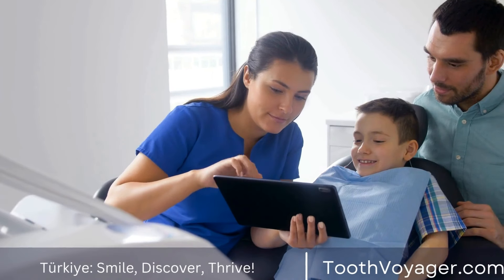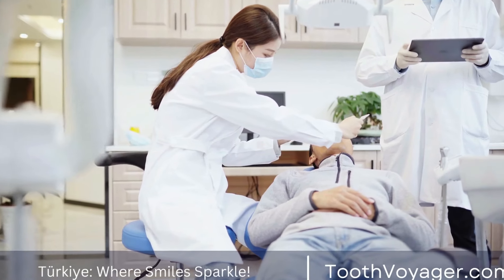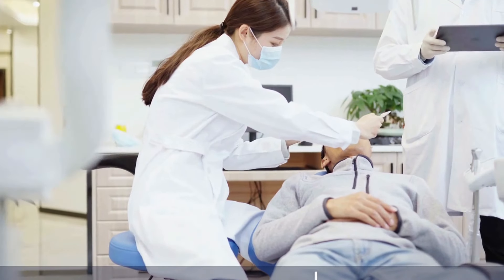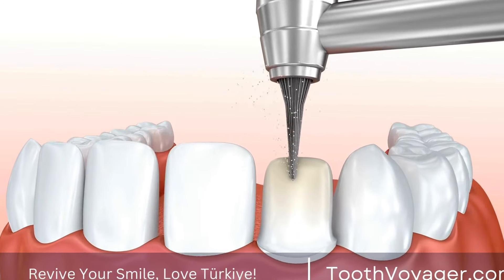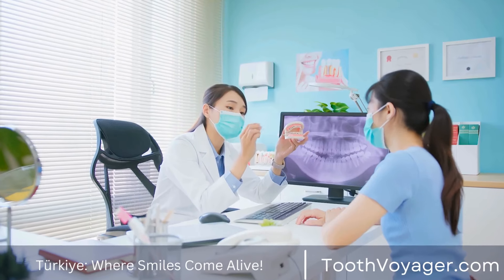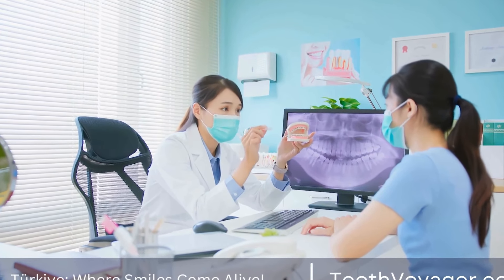Step 3: Accessing the Pulp. When the tooth has become numb and isolated, the dentist will make tiny holes in the crown of the tooth in order to reach the pulp chamber. The pulp is a soft tissue within the tooth which contains blood vessels, nerves, and connective tissues. If the pulp becomes damaged or infected, it must be removed to avoid further decay and infections.